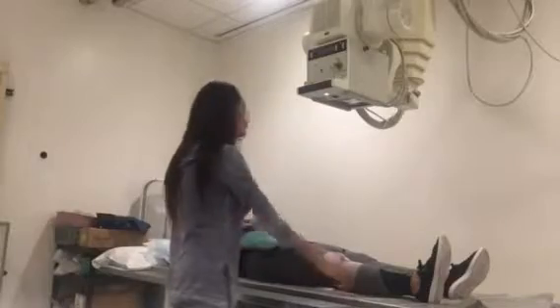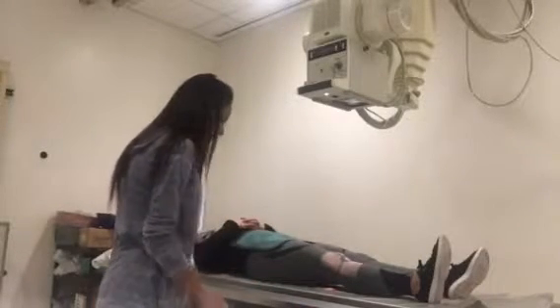I'll put my right marker. And then I'll go ahead and do my x-ray. X-ray, I'll come back, and I'll go ahead and change my IR, put a new one in.